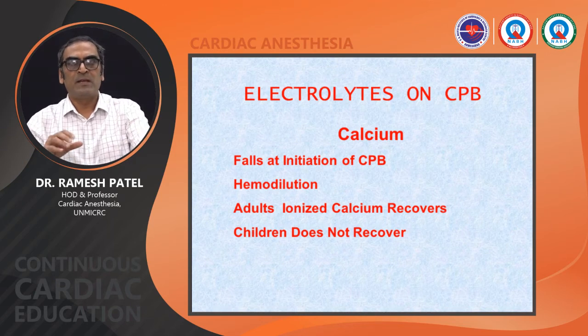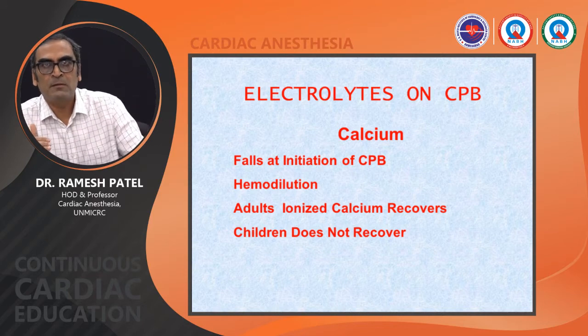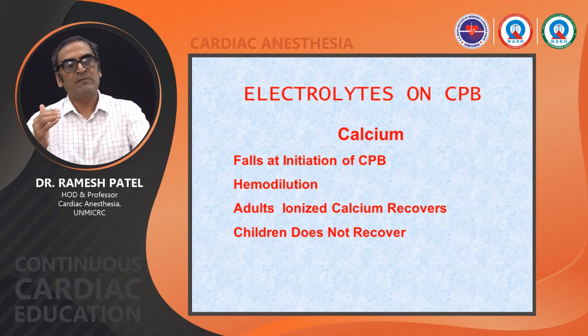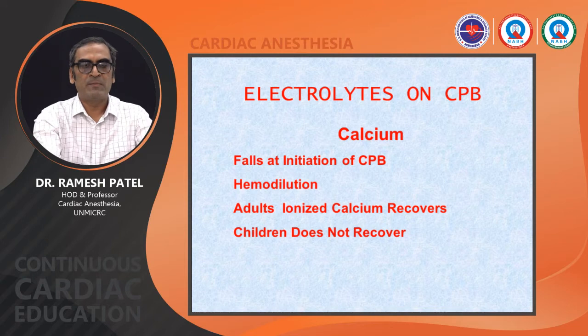Of course, we have to take care of some important minerals like calcium, magnesium and potassium. During cardiopulmonary bypass, dilution of these minerals occurs. These minerals are very, very important in maintenance of sinus rhythm as well as coagulation factor maintenance. So we have to take care of these vital elements, and supplement according to our laboratory data.